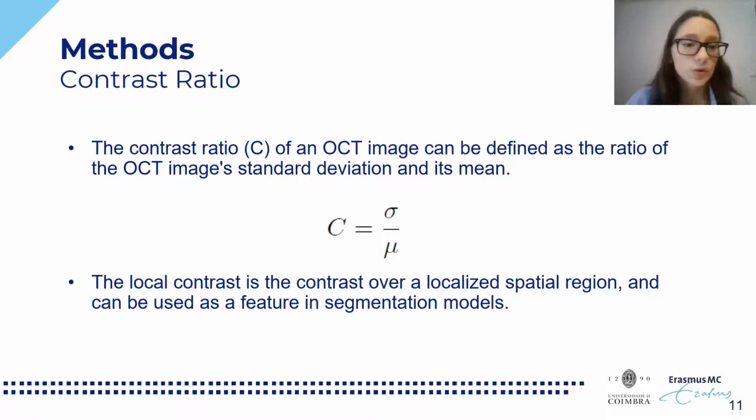But contrast is mainly used when there are moving scatterers in our tissue, because there will be temporal changes in the patterns, and these changes may contain very important information about the motion of the particles in the tissue.